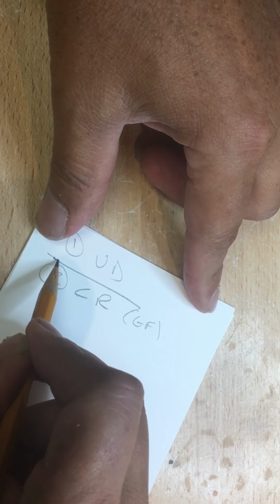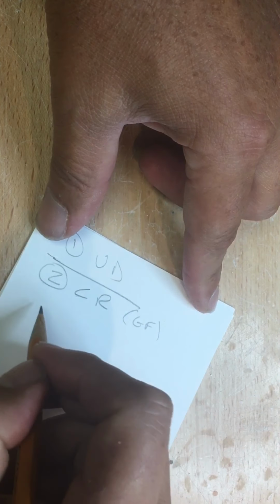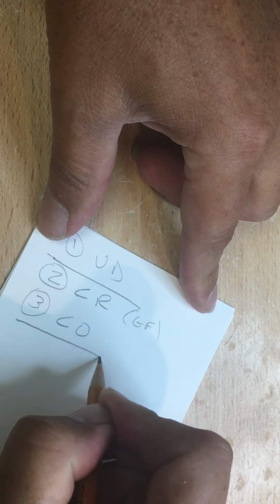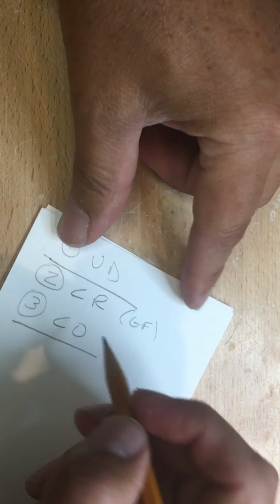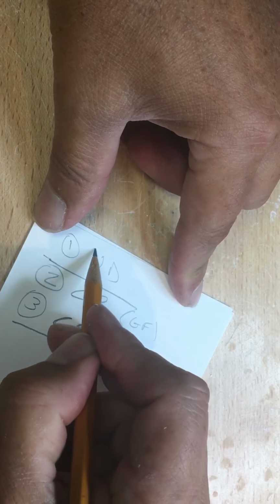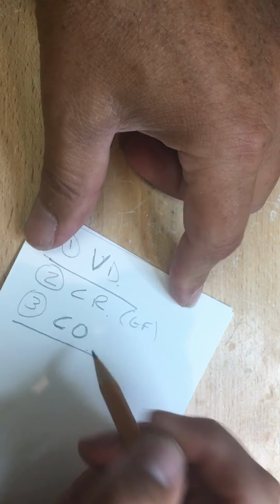Now, are we choosing centric relation? No, the dentist is. But this is what it's used for. Number 3, centric occlusion record, where this position is fixed. We cannot open vertical dimension if tooth-to-tooth contact exists. This occlusion rim will be used to take a centric occlusion record. So, let's go over them again, the top 3. Vertical dimension, centric relation, centric occlusion.